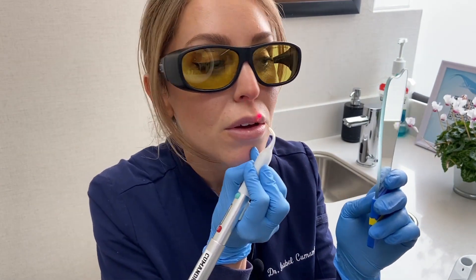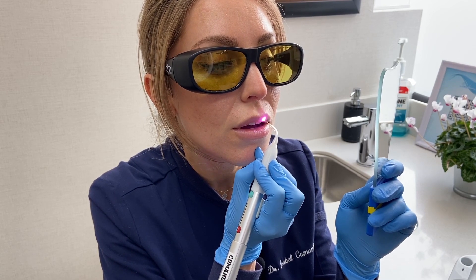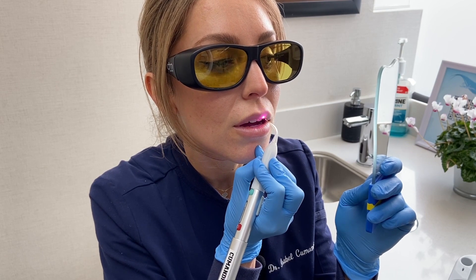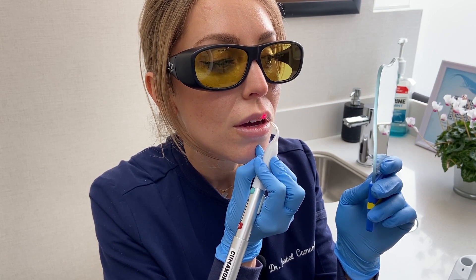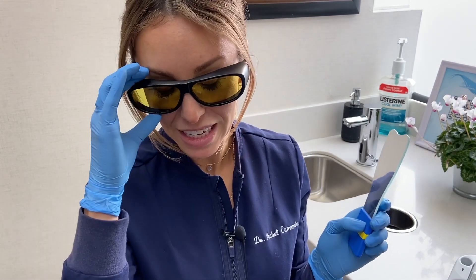All I feel is just warm — I don't feel any pain, nothing. And I get a little bit closer, just going in circular motions. Great, so that's it. If you do get cold sores frequently, this is something that can help. It works best if you do it right at the beginning of noticing the cold sore starting.